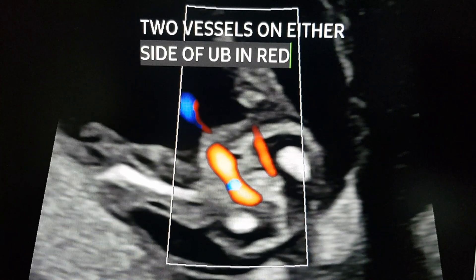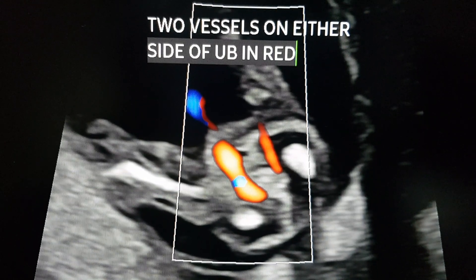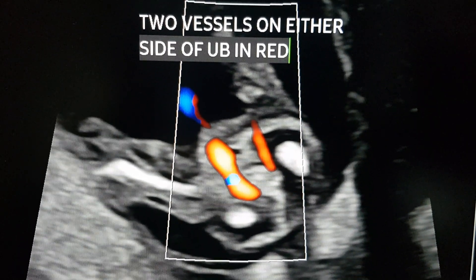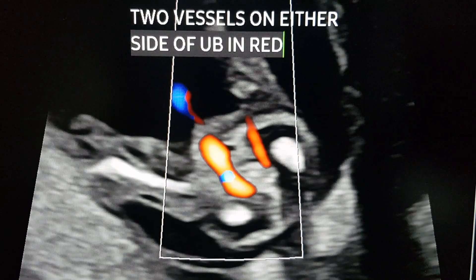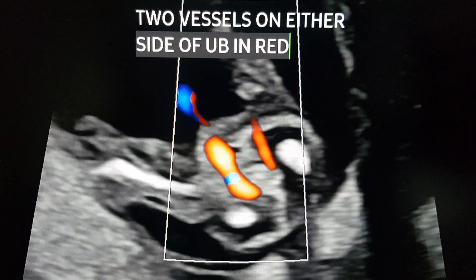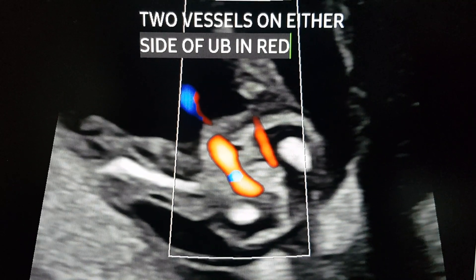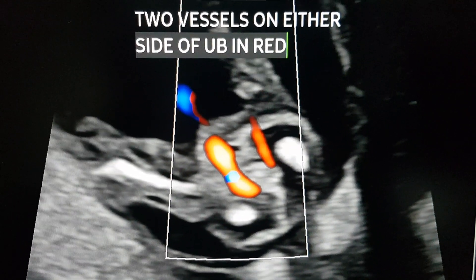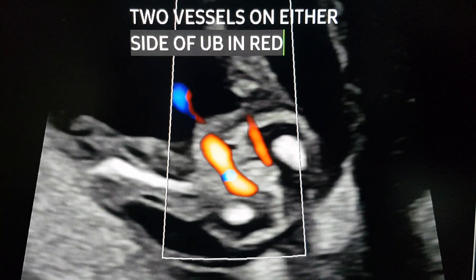is at the level of the urinary bladder in the pelvis. Here we have a cross-section of the pelvis with a collapsed urinary bladder flanked by two vessels filling in the color Doppler, both of which are in red. If one is in a hurry and just looks at these two vessels on either side of the bladder, we may infer that the cord is three-vessel with two umbilical arteries.